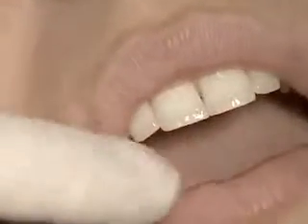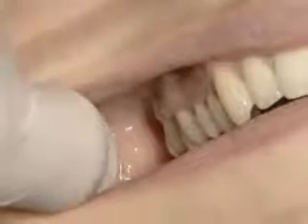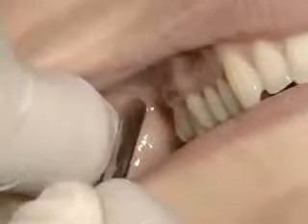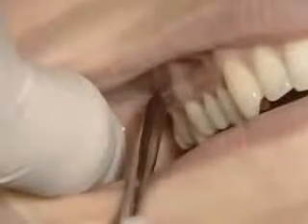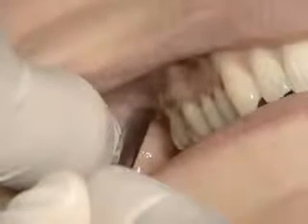For this block, you begin by palpating the intraoral landmarks. Just open slightly. I begin by feeling the coronoid process, and my finger is now resting on the coronoid process. The point of insertion is against that posterior wall of tissue, which lies here. The height of insertion is shown by the mucogingival junction of the maxillary gingiva, and this height is determined here. You draw the line back towards that posterior wall.